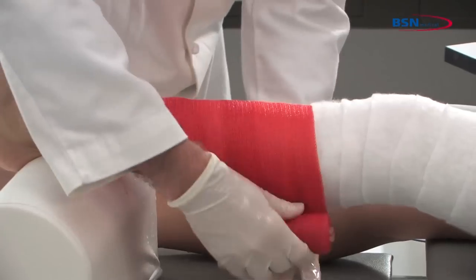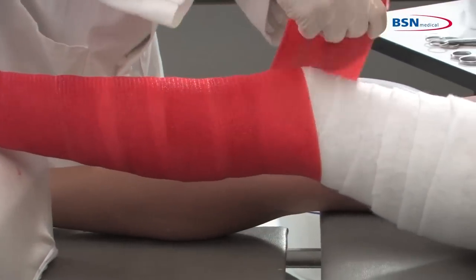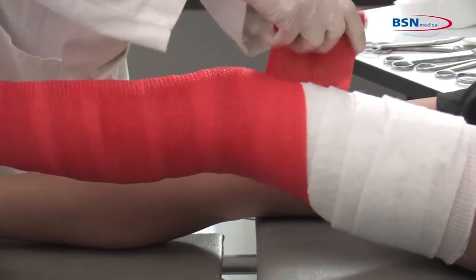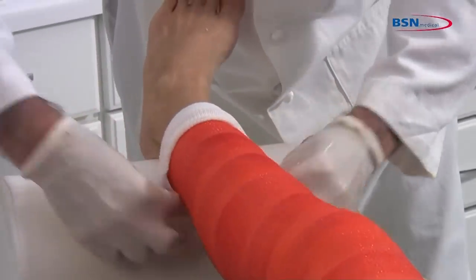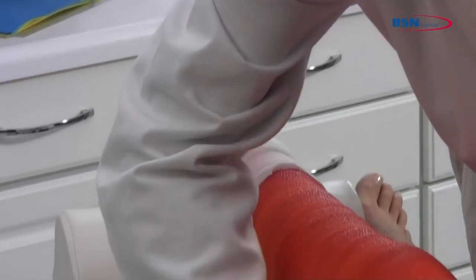Start wrapping the cast above the malleoli and overlap with 50% toward the proximal femoral shaft. Fold back the stockinette at the proximal and distal end for protection of the skin and soft edges.